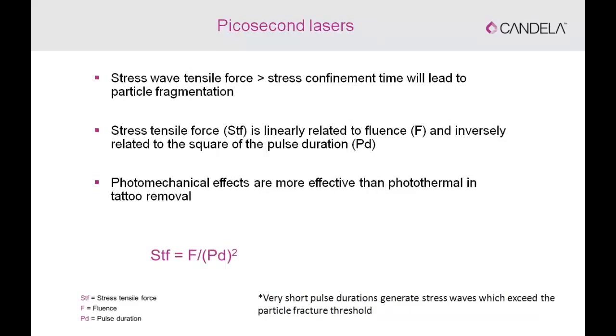To fragment and break down a particle, and in this case we're talking about an ink particle, the short pulse durations in the picosecond domain will generate stress wave tensile force. And when the stress wave tensile force exceeds the stress confinement time of the particle, that leads to fragmentation of the particle. So you would need to have a stress tensile force that is higher than the stress confinement time.